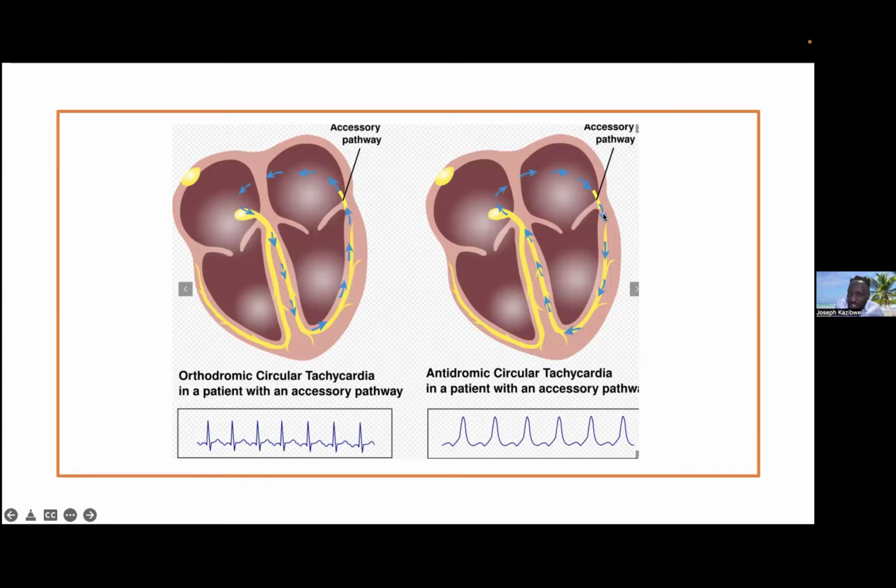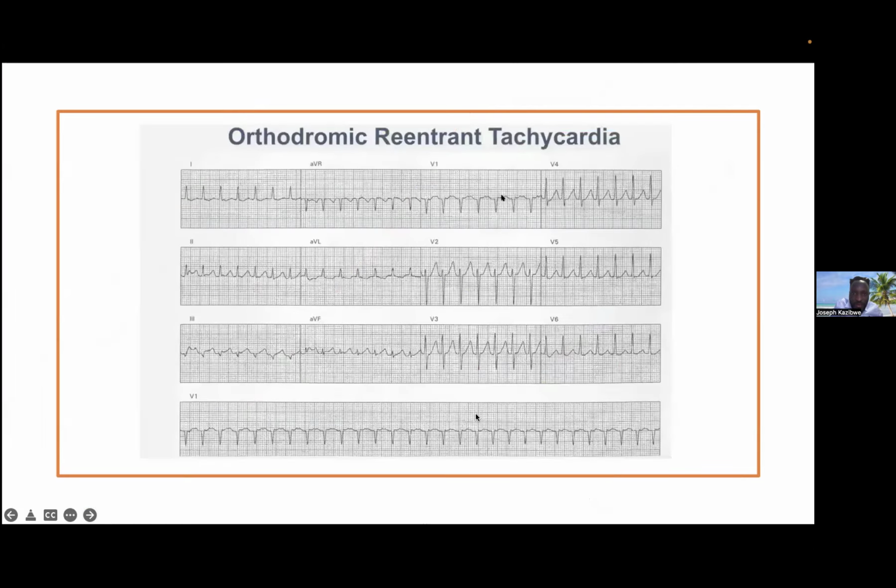But remember also, because you're activating the myocardium itself, the big one, you have a broad complex. Because you have both, the AV node route is going to delay a bit, but the accessory pathway is not going to delay. So it gives you a short PR. It starts the broad complex, but as it goes through here, it goes very slick. So you have a fusion of this and that, and that is how we end up with the delta wave.